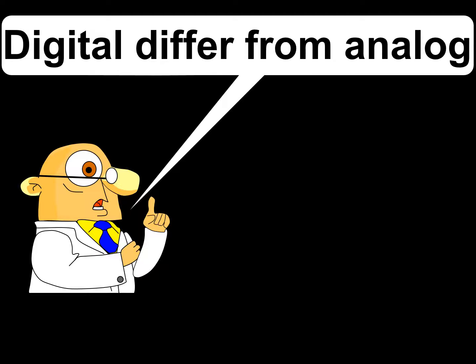So in reality, changing a montage during digital EEG reviewing, and now all EEGs are digital, is not viewing new information gathered from different perspectives, as it was in the classical world of analog machines. It is looking at the same information processed in different ways.